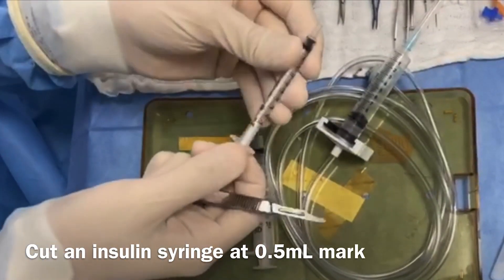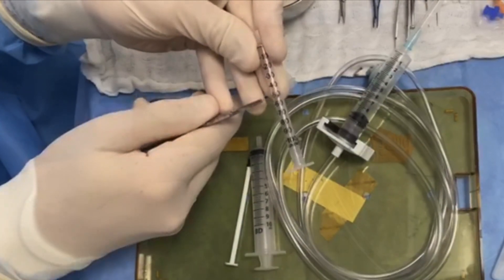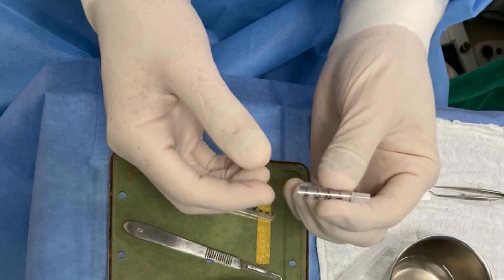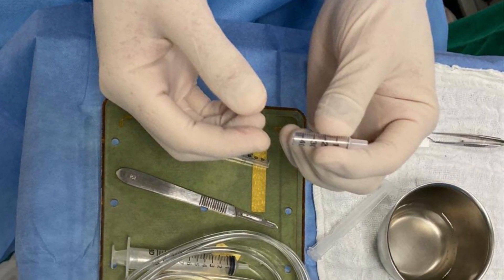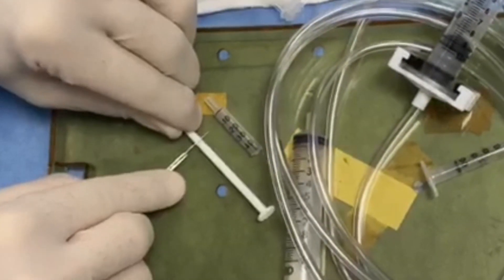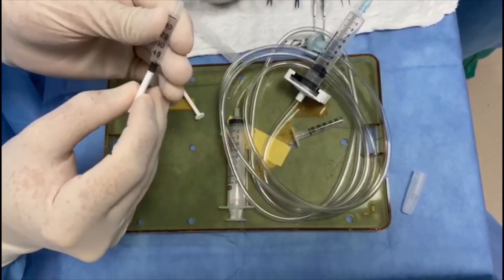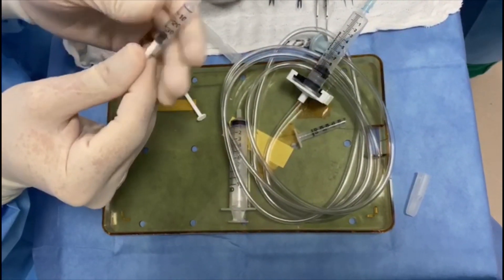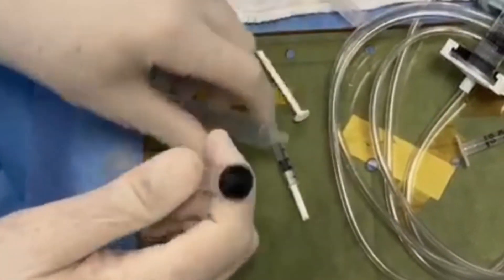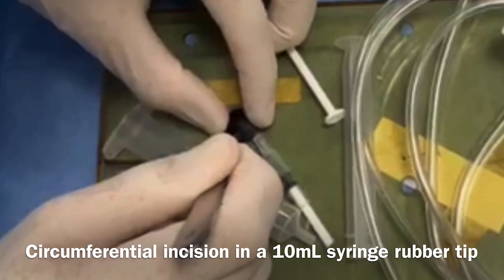To prepare a TPA injection system, first an insulin syringe is cut with a scalpel at the 0.5-milliliter mark. Then the plunger is also cut, leaving one centimeter longer than the syringe body. Next, the rubber tip of the plunger on the 10-milliliter syringe is removed and a circumferential incision is made.